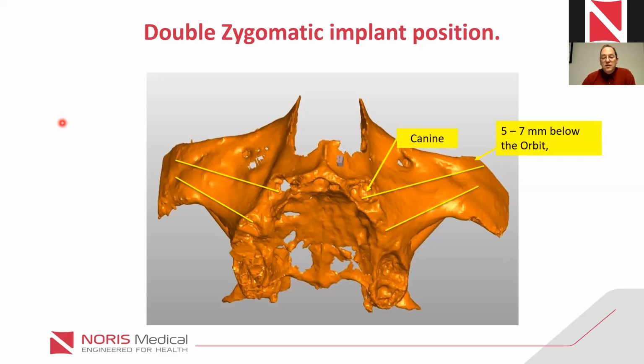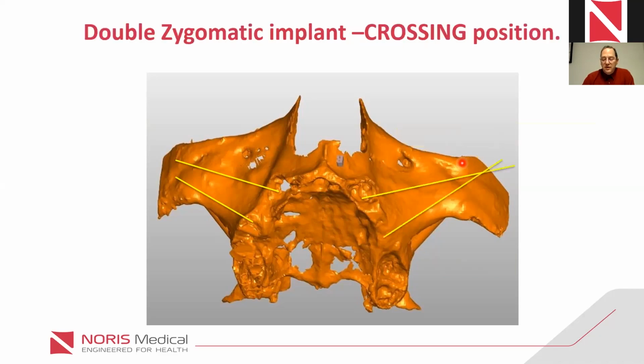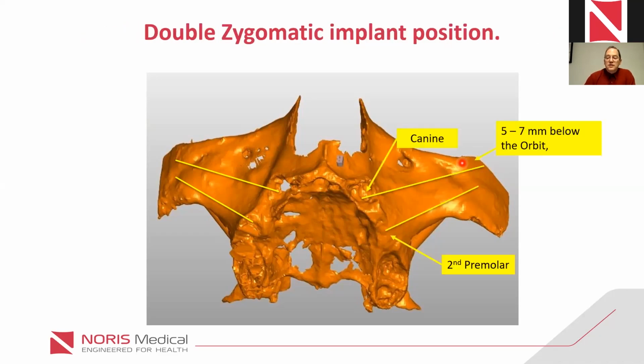We talked yesterday also how this is tricky because not always what we see from here is exactly the distance. Maybe I'll go about over again. And the posterior implant would be something like a second premolar, and aiming towards the zygoma notch without colliding with the anterior implant.